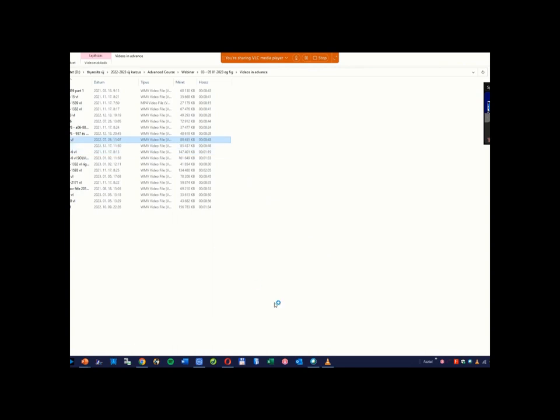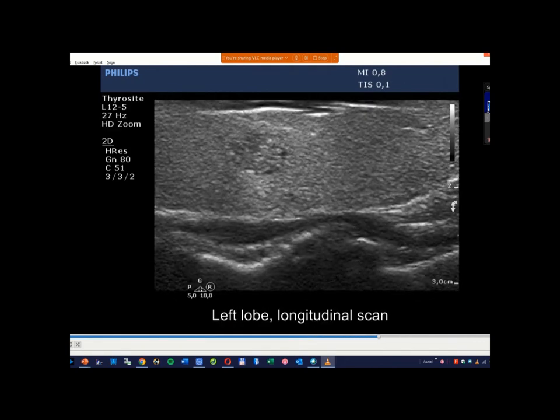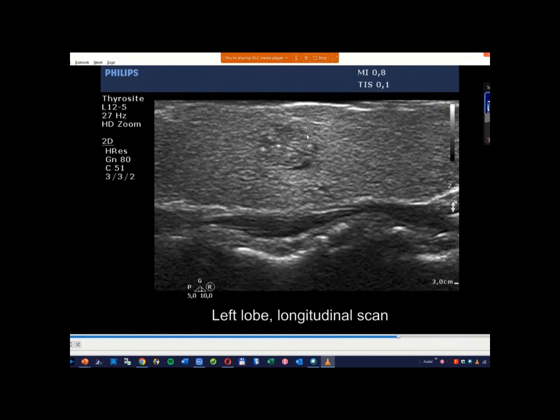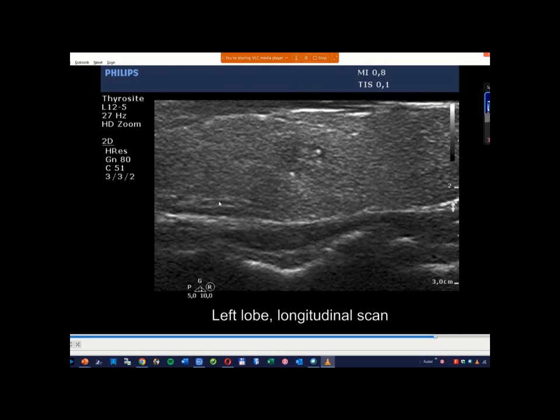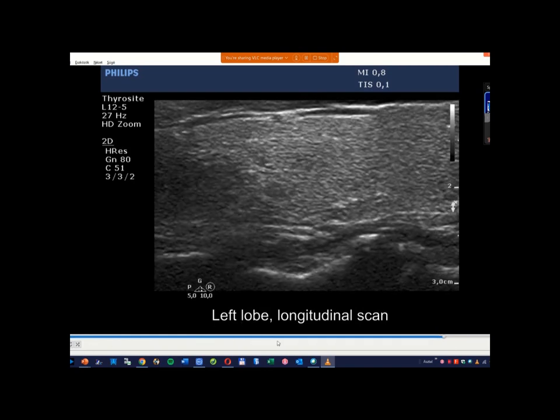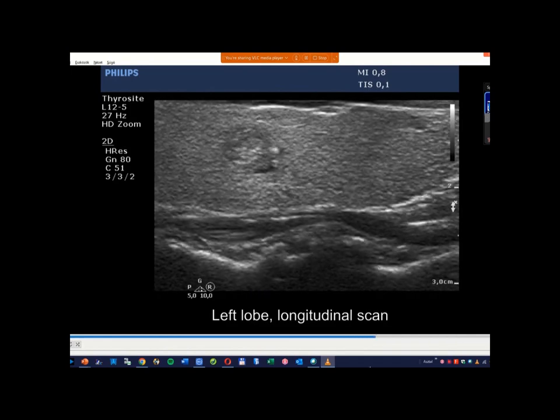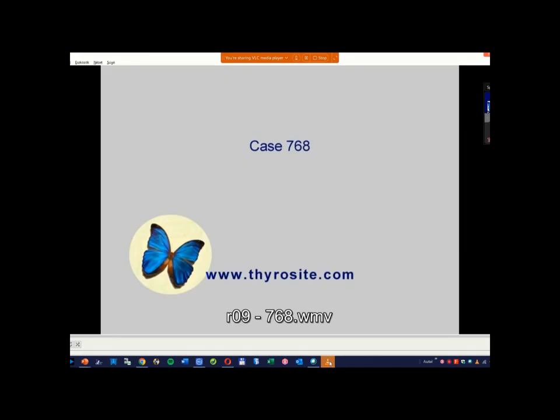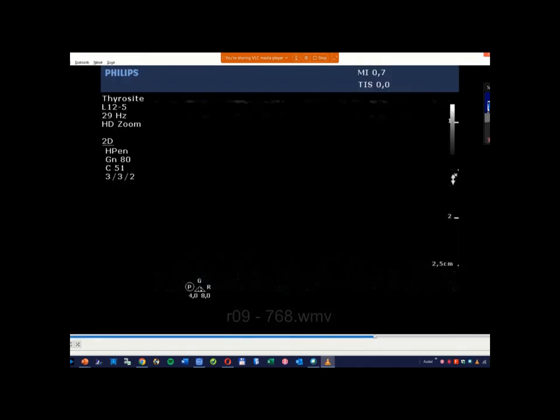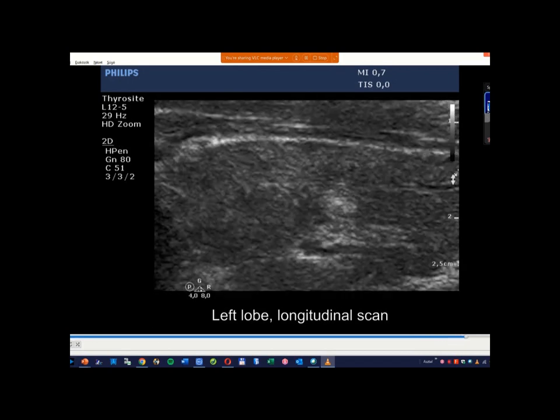I go back to the previous case. In this case, almost exclusively within the lesions are granules. Okay, the connective tissue background or backbone can be seen anywhere within the thyroid, but it is a normal finding. Such bright granules are almost exclusively within this lesion. So this is really a concerning pattern. While that one is much, much less concerning because such granules are found as well in the thyroid, not only within this lesion. Was it quite clear?